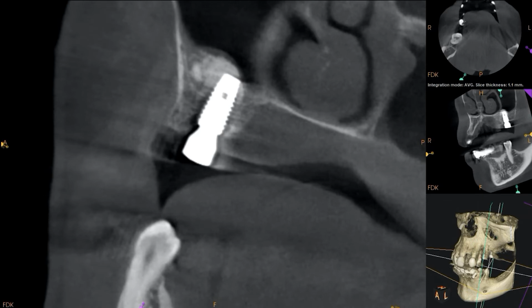Obviously, the first thing we will look at is the sinus graft. I like our graft material. I like that it's compact, it's close together. It's just another reminder that we did not perf the membrane, the fact that the graft is well contained, densely packed together. I like what I'm seeing there. A little bit of style point loss, the fact that the graft doesn't make it all the way over to the medial wall. I don't see a big clinical outcome to it being that way, but you know, I think it's going to work just fine.